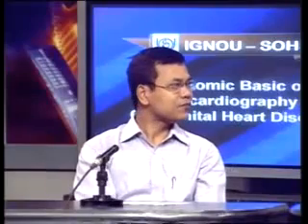Then you open the great vessels. You are seeing two great vessels in one view, arising either concordant, discordant, double outlet, whatever, but two vessels. You will say, I am seeing two great vessels. Then you have to follow them entirely and define their course, whether it is going to form the pulmonary artery or the aorta. Only at the level of the valve you cannot say it is aorta or pulmonary artery.